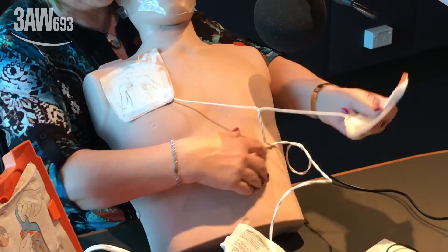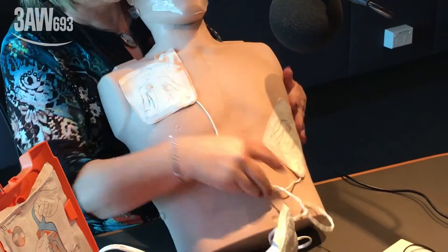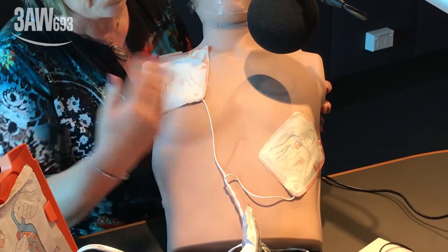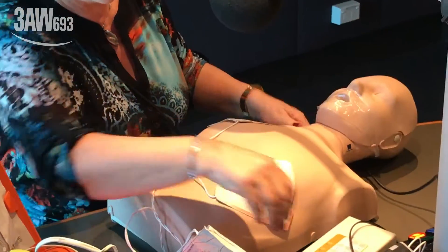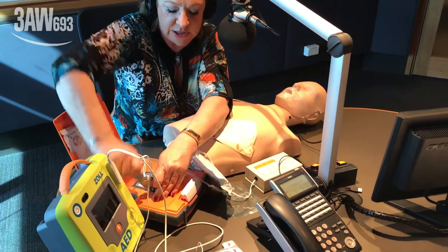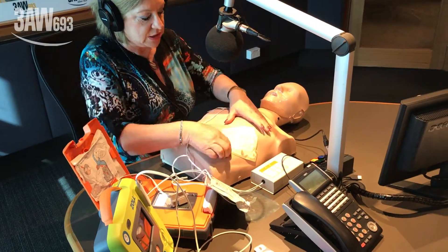Now peeling the second pad. The device instructs: 'Peel the second white pad from the blue plastic.' But where do you put it? Top right under the collarbone, and the lower one on the left side of the chest under the nipple. A simulator is switched on to continue the demonstration.